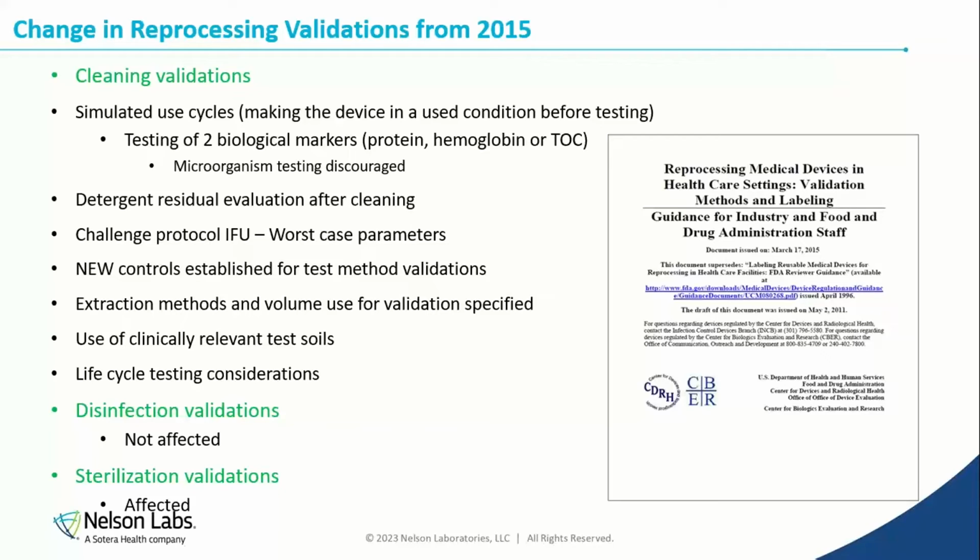Sterilization validations were affected a little bit because now everything had to be FDA cleared. You had to use FDA cleared supplies, you had to use FDA cleared wrap, you had to use FDA cleared sterilizers for the validation. So that is when we started to see the shift.